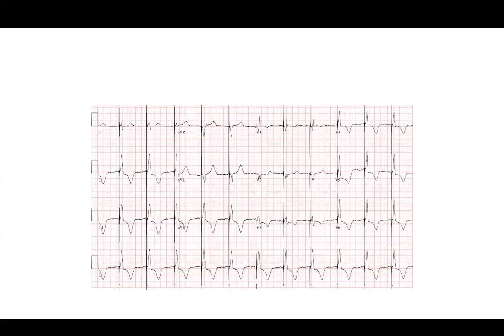It always looks better in unipolar, I find. I think you have to be careful because when you're doing your threshold, when I finish the unipolar testing, I do bipolar testing and do the threshold and I come down super slowly, every 1 or 2 beats by 0.1. And you can see that step out on the current of injury on your left bundle pacing EGM. And you can see that typically on bipolar, that change from non-selective to selective will occur around 2.5 volts. And so I think you need to make sure that you're programmed more than 2.5 volts if you're going to be programming bipolar in your final parameters, to be able to use that anode. You see what I'm saying? Yeah.